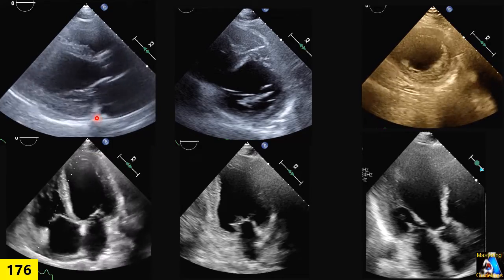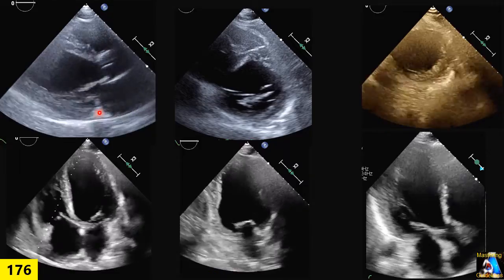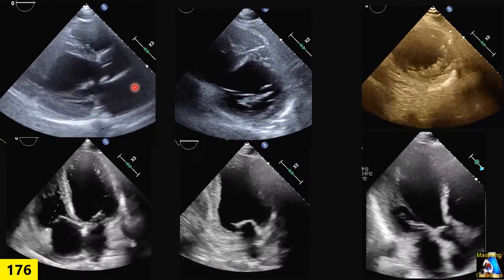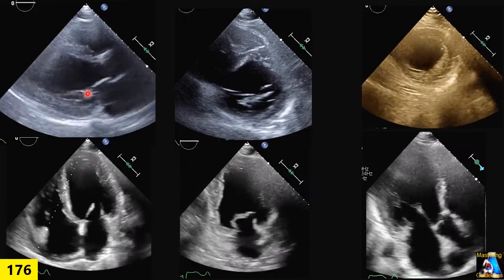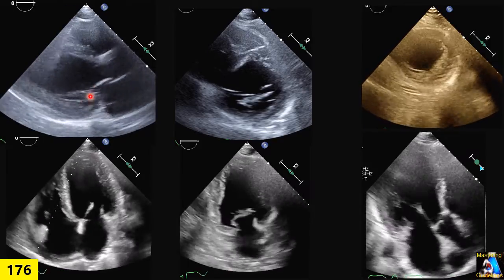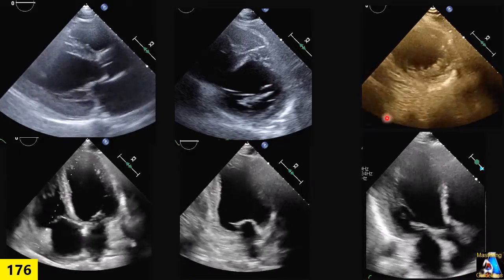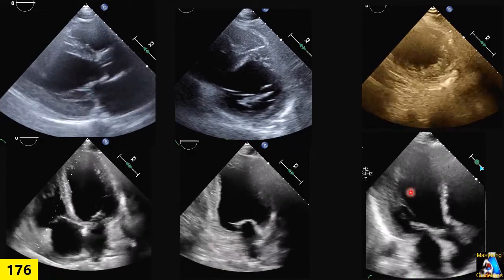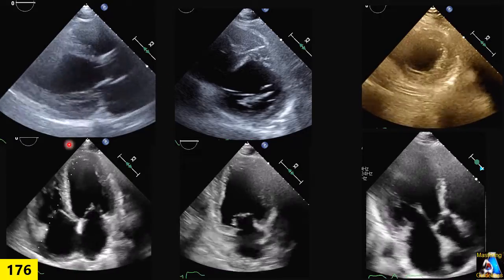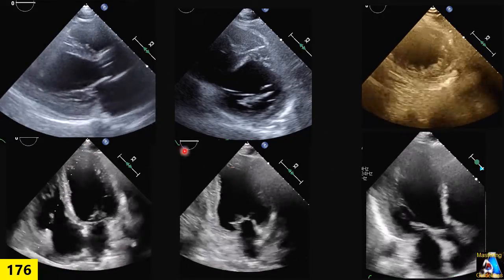We have a middle-aged patient after a massive MI, sent three weeks later for follow-up. The tech did this study. As you can see on the views — PSAX, mitral, apex, apical 4, 2, and 3 — you can see low ejection fraction, wall motion abnormality, and all those findings.